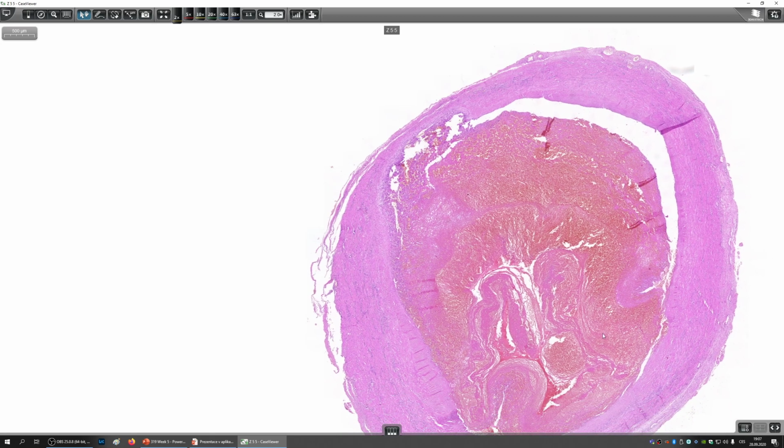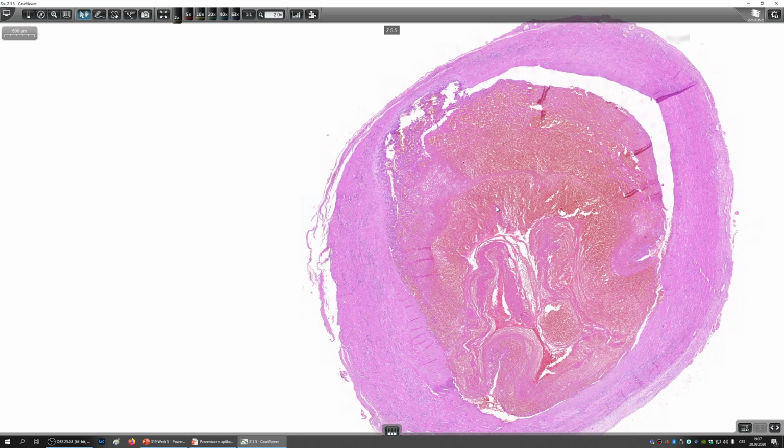So this thrombus might have existed for maybe 2 weeks. So it's going to take logically months until the entire thing turns into granulation tissue or scar tissue. So one of the fates of a thrombus is turning into scar tissue through organization. Naturally, the organization can be only partial, so you can have the so-called recanalization. In this case, parts of the thrombus can become patent again, so the lumen of the vessel will be smaller, but you may have different neolumina through which some blood is flowing. This is another possible fate.